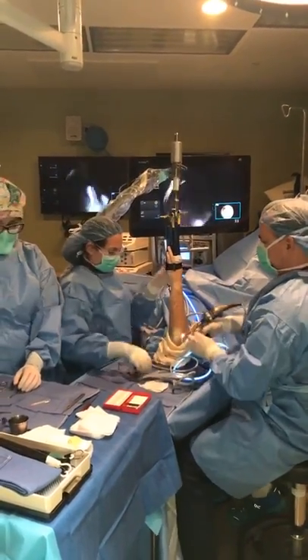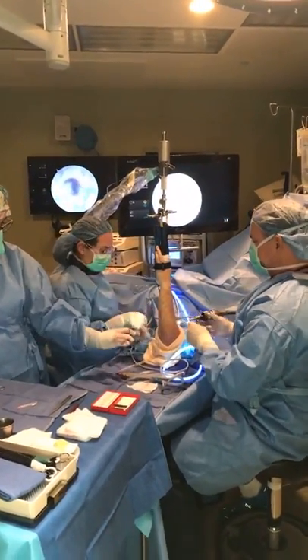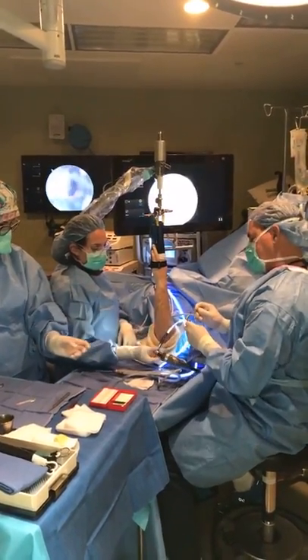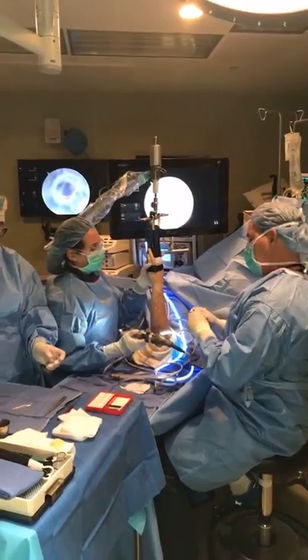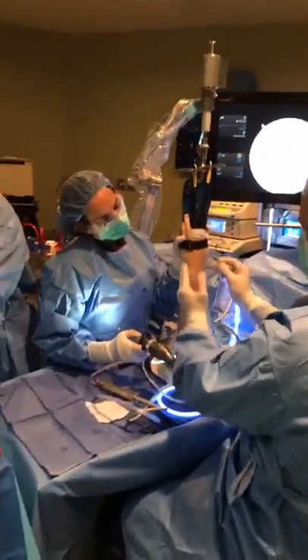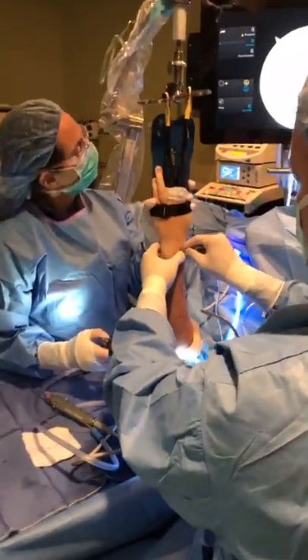So now we're going to go and finally do the repair. We're going back into the radiocarpal joint. These portals have numbers or names based upon the relationship to the extensor tendons.